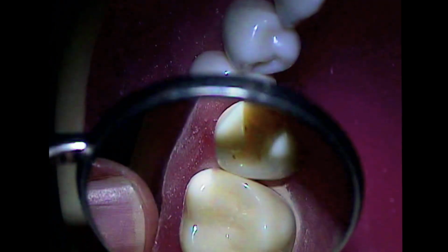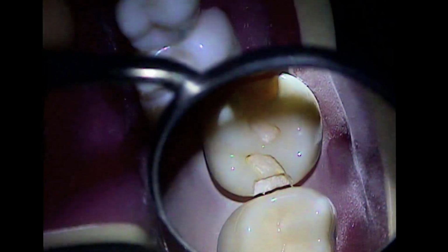Okay. So you're going to have a little trouble doing the... No, I'll just do one over there, whenever, in between. Okay, so what do you think about your DO so far?